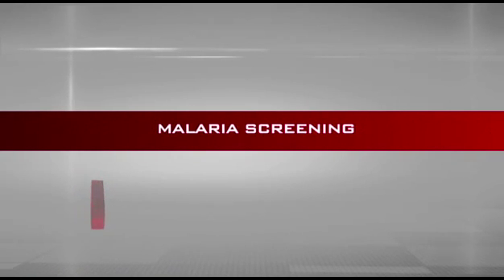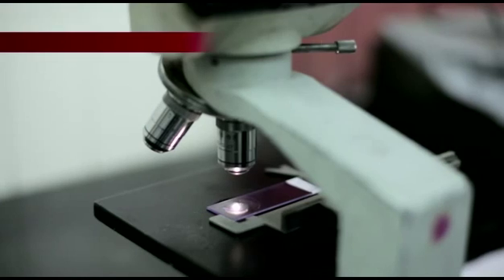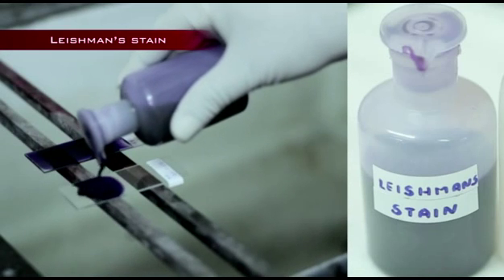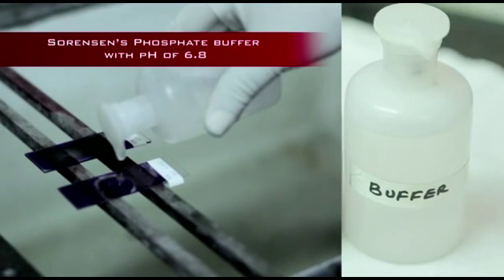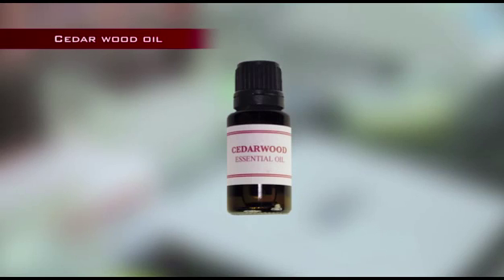Malaria screening. The materials required for malaria screening are microscope, glass slides, Leishman's stain, Sorensen's phosphate buffer with pH of 6.8, cedar wood oil.